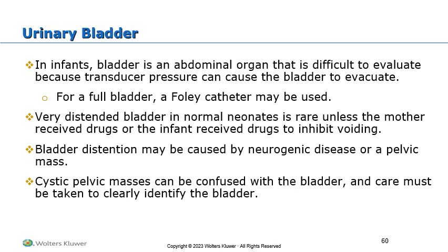Woohoo, we finished the kidney. So on to the bladder. So the urinary bladder in infants is considered an abdominal organ. It really doesn't settle into the pelvis until later in life. Now, because it's an abdominal organ, and because especially infants or even younger toddlers have not really developed the control of micturition at that point, it can be challenging to get images of a full urinary bladder in our really young population because the pressure on the bladder causes it to evacuate.